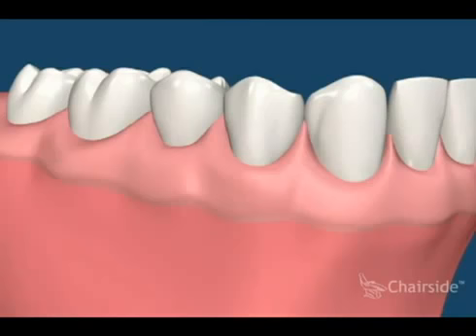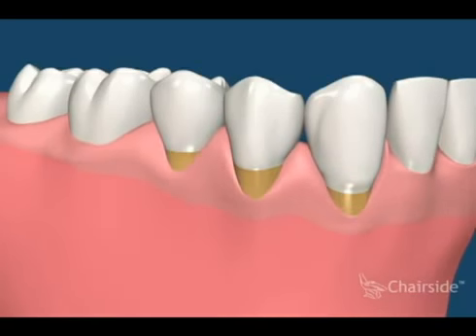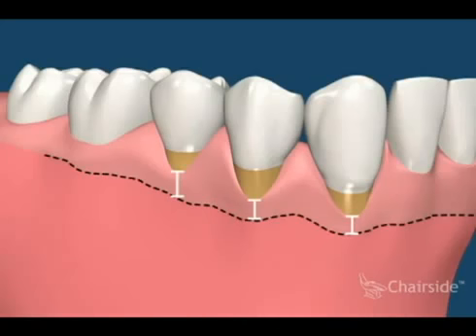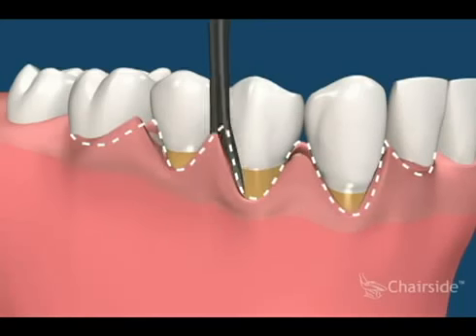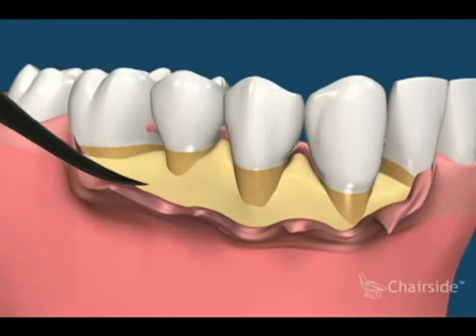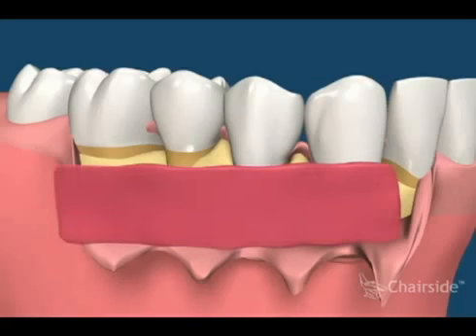Teeth may experience recession where the roots become exposed. This movie demonstrates a situation where some teeth have also lost their tough gum tissue, or attached gingiva. Attached gingiva holds the gums firmly to the teeth and prevents calculus or tartar building up between gums and teeth. To treat this condition, the flap is reflected from the teeth. A prefabricated human graft tissue can be placed into the area.